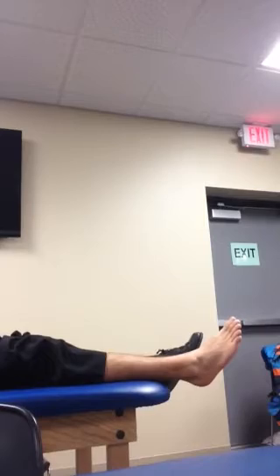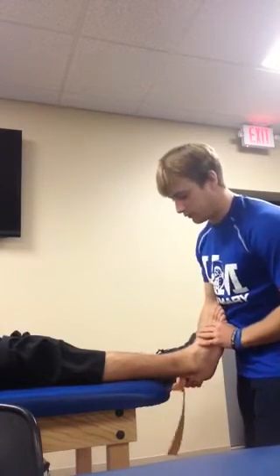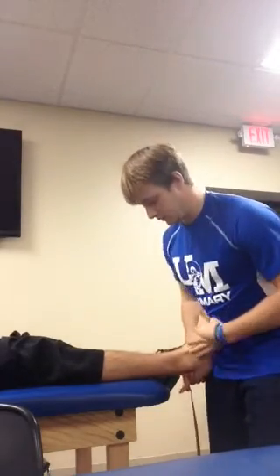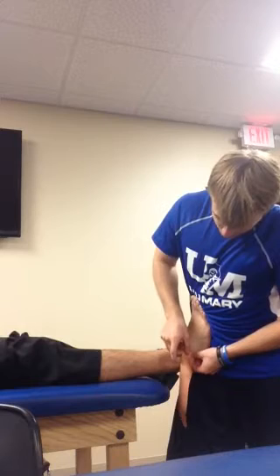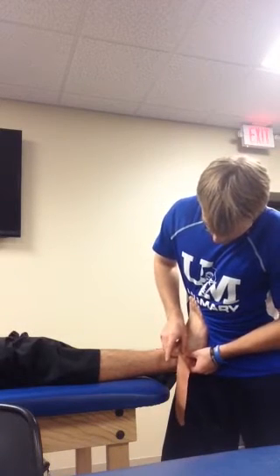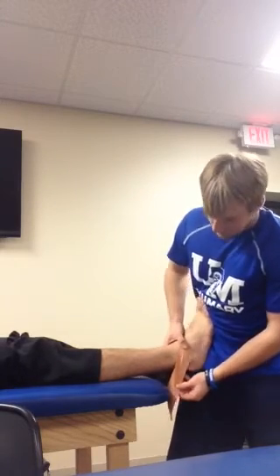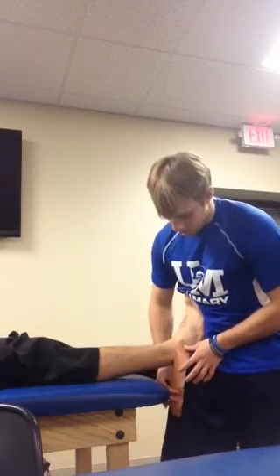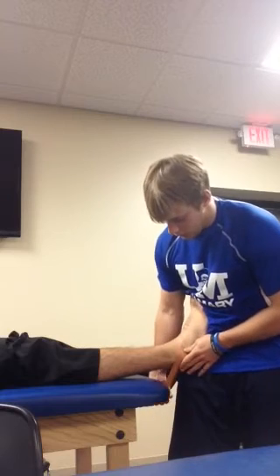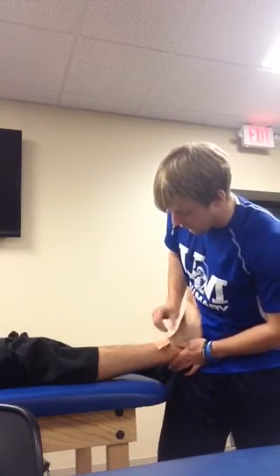So I'm going to go ahead and demonstrate it for you. I'm going to have the patient's ankle, the talocrural joint, in the neutral, slightly dorsiflexed position. I'm going to take the tape and apply it right in that sinus tarsi location, or on the head of the fibula, or the lateral malleolus, and now I'm going to apply a force posterior and superior with the tape, and then strap it around the anterior side just like this.